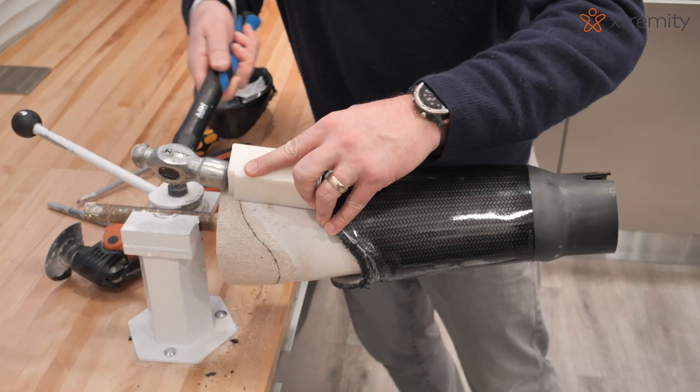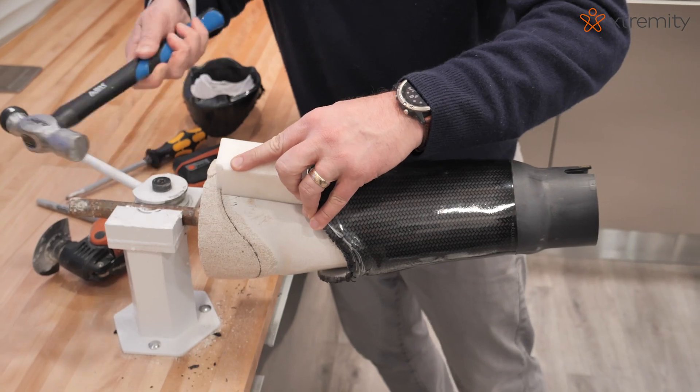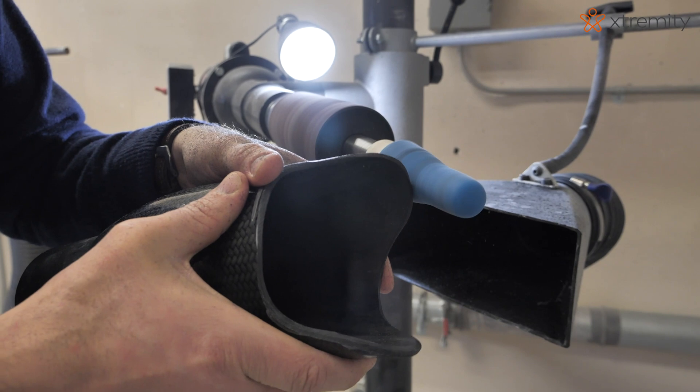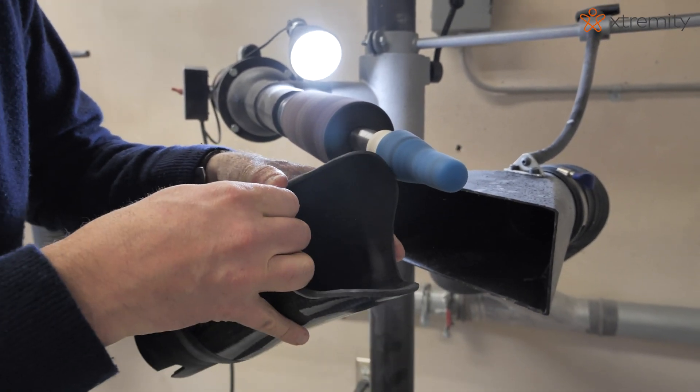Remove the socket and smooth and buff the proximal brim of the socket. Ensure the outer surface of the brim is smooth to preserve suspension sleeve life.